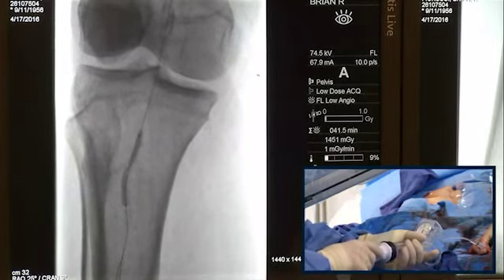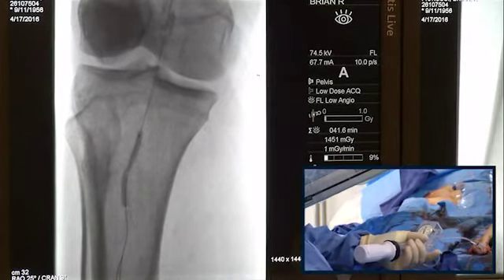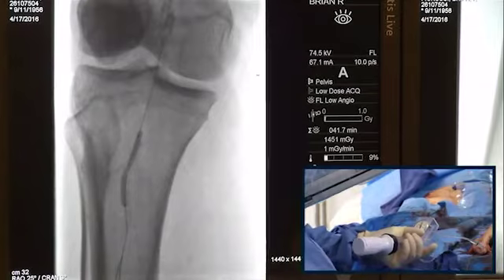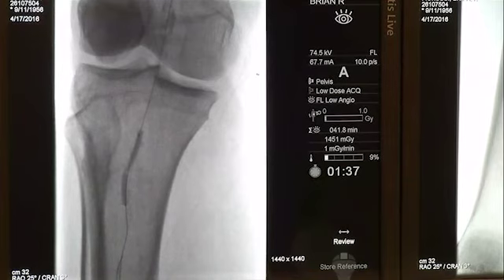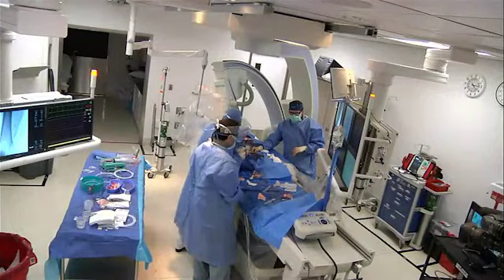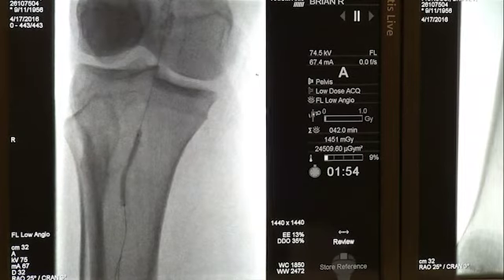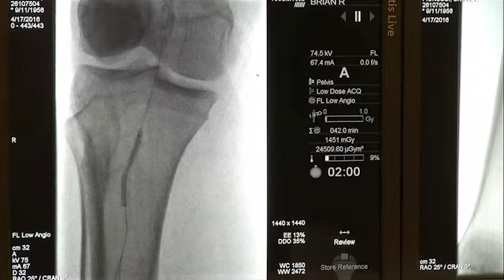This is 14, and you mentioned that, so in memory of Dr. Whitlow, who, as you may know, Dr. Walker just passed away two weeks ago. Yes, we actually call this maneuver the Whitlow wiggle. At least that's the term I've given it, because that's what he taught me to do when we used to do those tough coronary lesions. Basically, you go to your maximum pressure. In this case, I'm at 14, and then I just go down to 10 and back to 14 and do this maneuver multiple times. I remember working with him, nine out of ten used to work eventually. That's something I learned from Dr. Whitlow, and I continue to do.